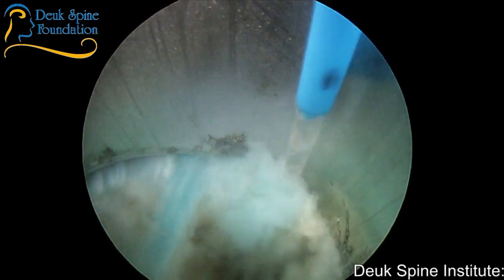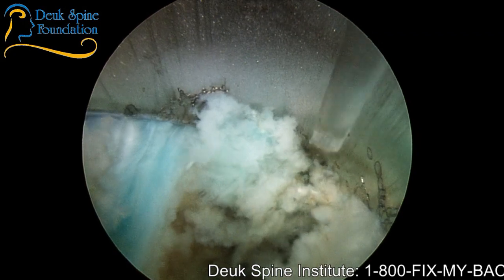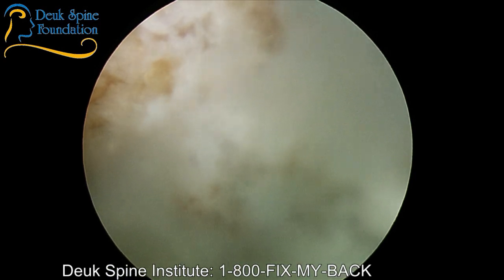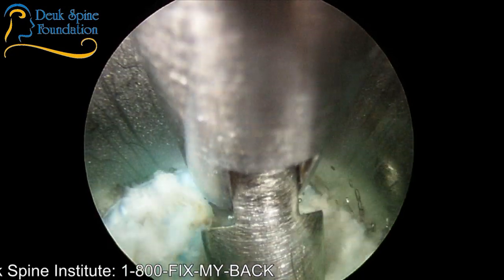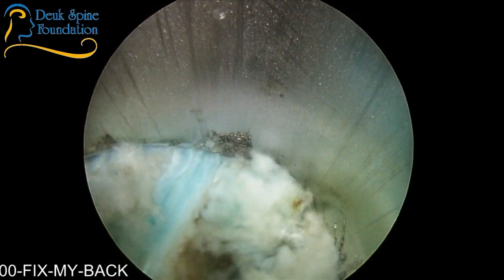So this is all herniation. You see that stuff coming out? That was out where the nerve is, but I kind of shoved it in, standby laser. When I put the dilator in, remember I banged the dilator in? So that actually pushes some of the herniation back into the disc, and now I've got to go retrieve those fragments because they're at risk for coming back out again after surgery. So we don't want that to happen.